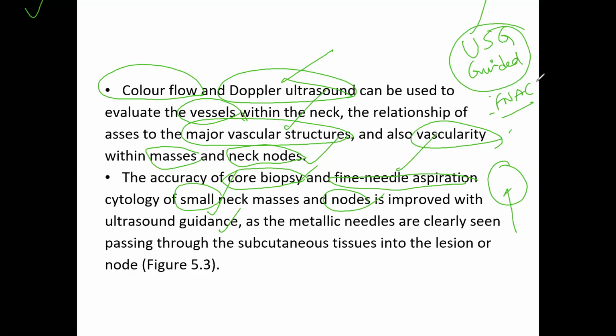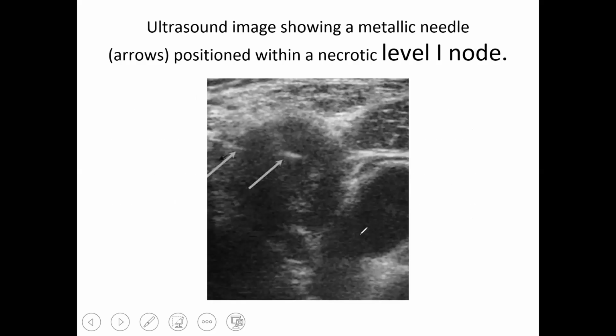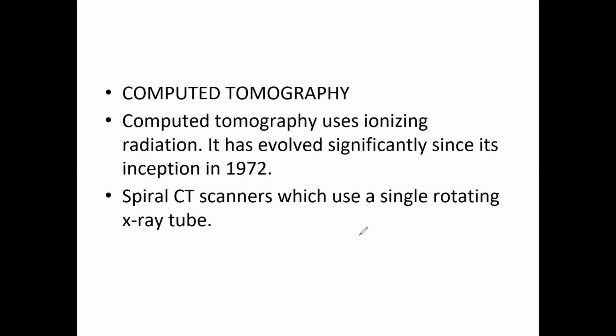The metallic needle in the previous picture is shown again with the arrows. Next, we are going to go for computerized tomography.